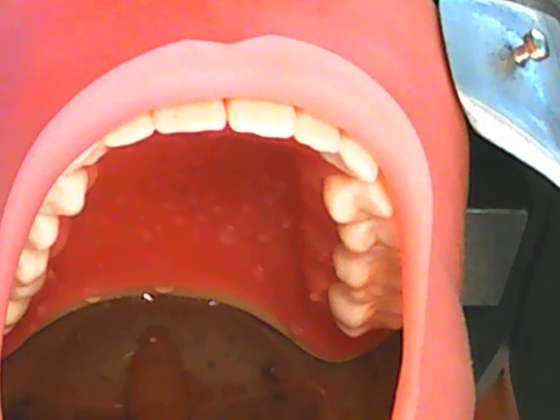For a premolar isolation, I like using the Ivory 00 clamp, which is my preference. There are other ones on the market that are just as good, I'm sure.